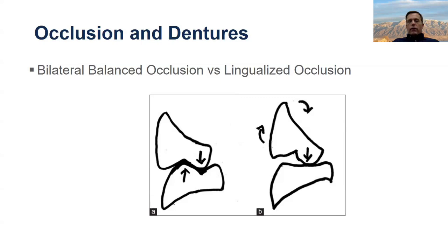So you guys know that posterior denture teeth are categorized by the angle of the buccal and lingual cusp planes relative to a flat surface. They're offered in a variety of angles, but they're commonly 0, 10, 20, 22, 33, and 40. Usually the teeth with larger angles tend to look more aesthetic. But because of that lateral movement that your denture patients are making in chewing, many times the higher cusp angle teeth, especially set in balance, can generate a lot of tipping force when the patient moves in lateral.